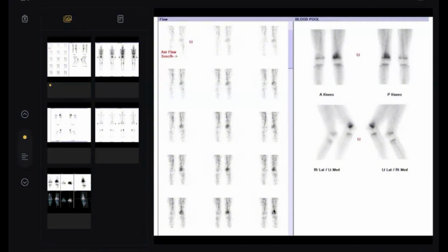Besides the X-ray, but again and again, a stress fracture is like osteomyelitis. Why? Because in a stress fracture there is a reparative osteoblastic reaction, so you must see uptake in the delayed phase. Doctor, how do we differentiate a stress fracture from osteomyelitis? Clinically, okay? Ask if the patient has fever or not. Do a CBC. Okay, my colleague?